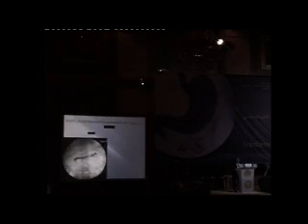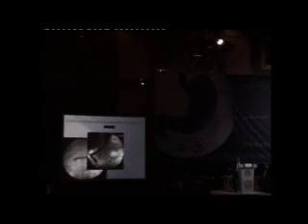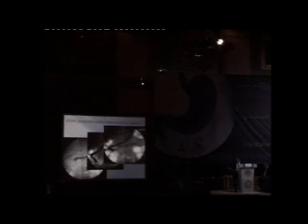So we put a nasobiliary tube, nasopancreatic tube, and then we cracked it with extracorporeal shockwave lithotripsy into several fragments, and then dilated further with a 10 millimeter balloon dilator, and then with the mechanical lithotripter, we removed all the stone fragments, and the patient did very well, discharged from the hospital. So far, I've been following the patient for 7 years. He's totally asymptomatic. Now, what about if there is a pancreatic stricture?